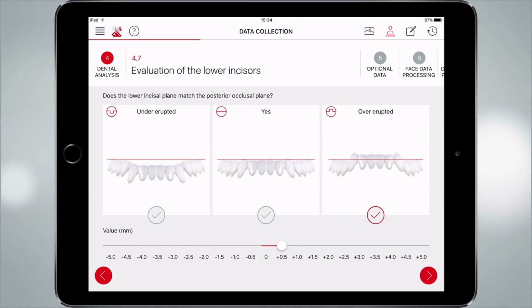That will be very important for orthodontic reasons, but also for the need maybe to increase the vertical dimension in full mouth rehabilitation. In this case, we can add some height on the posterior area of the lower arch to compensate the over-eruption. So in this case, again, we are in the perfect situation. We are normally erupted, not over-erupted or under-erupted.